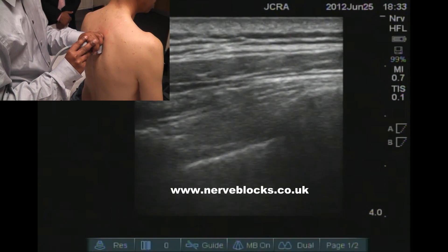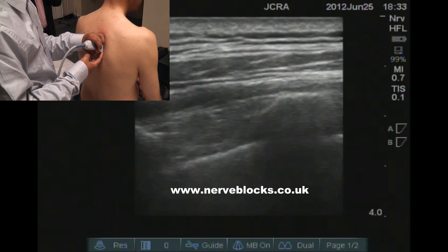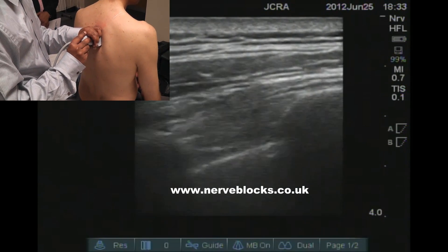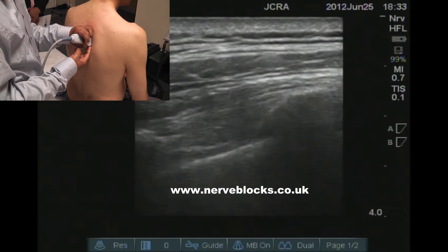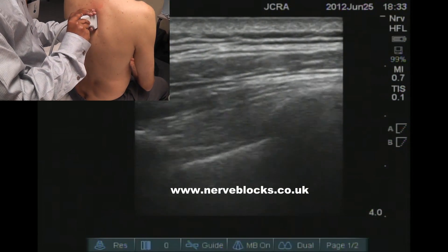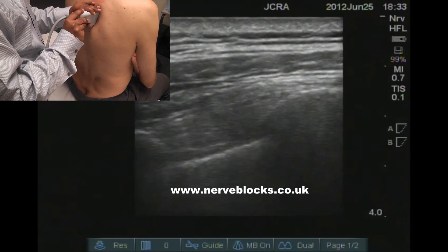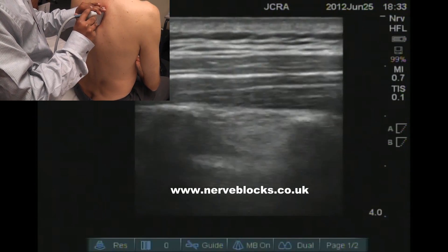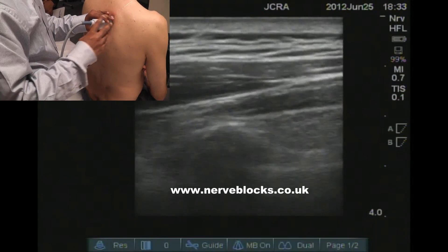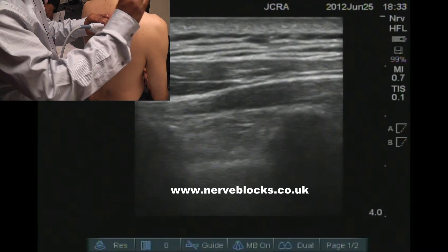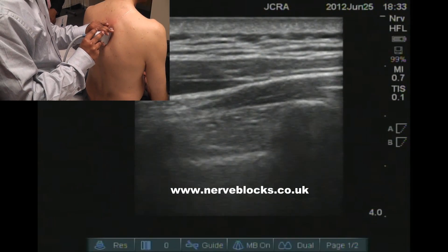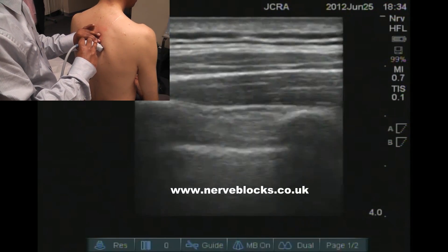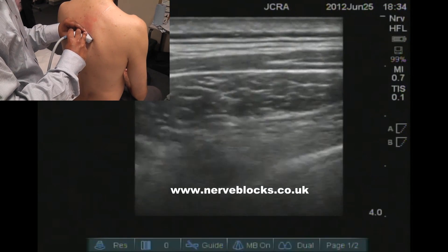It may be useful to put some color Doppler to see if there is any vascularity. If you can't see the picture with a linear probe you can use a curvilinear probe. Once you are in the process of injecting, you can turn the probe along the longitudinal plane to see whether your spread is happening to the other spaces by seeing the distance between the pleura and the intercostal membrane. You create a pocket between the muscles and the pleura so that it spreads along the gutter, then get your probe back to position and inject the full volume of local anesthetic.